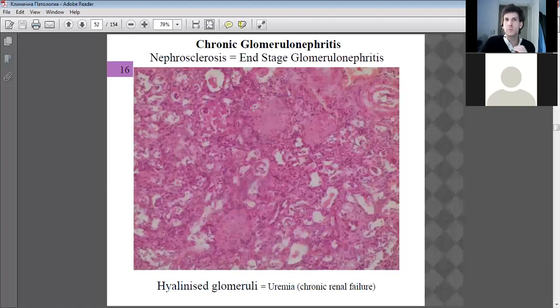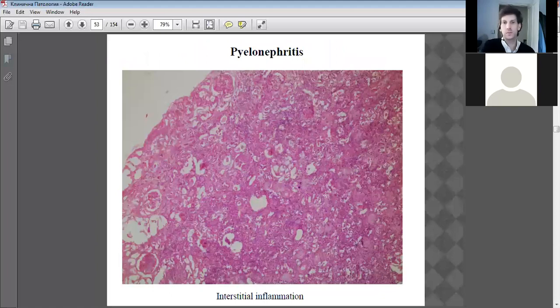So you get what's called metabolic alkalosis, and as the ammonia breaks down, you get then metabolic acidosis, and those two, acid and alkali, are tissue destructive. As you can see, the whole tissue here is breaking down. Lots of spaces of non-functional tubules. Yeah, it's very serious indeed.